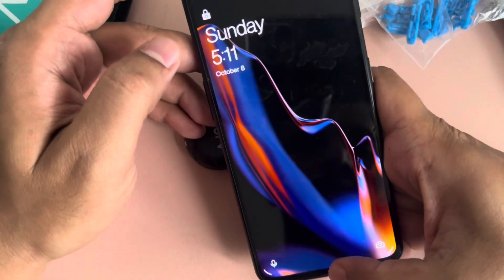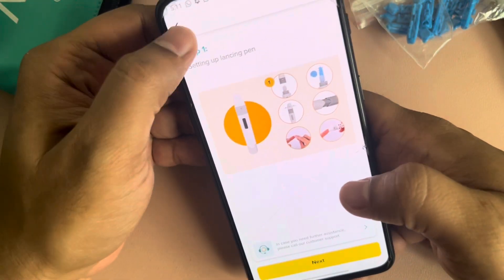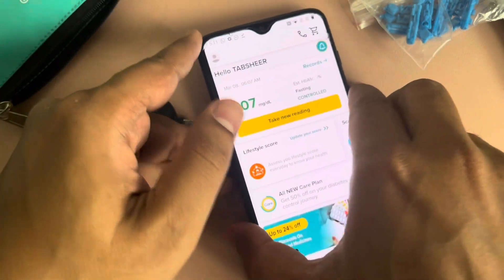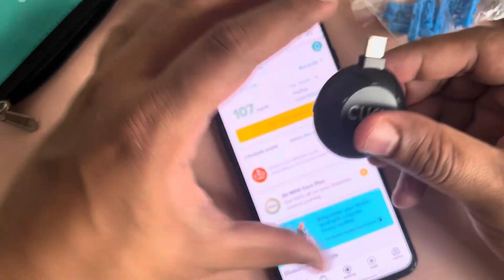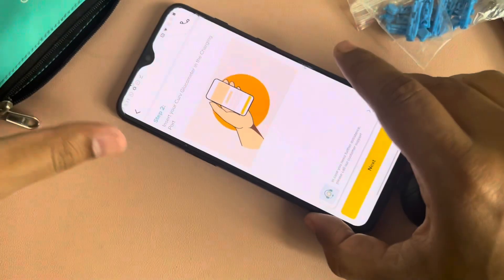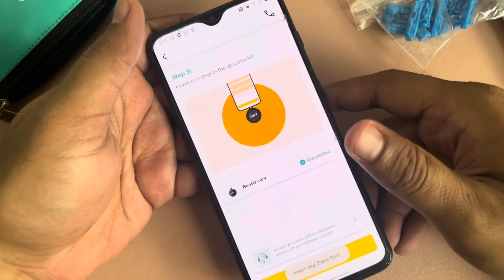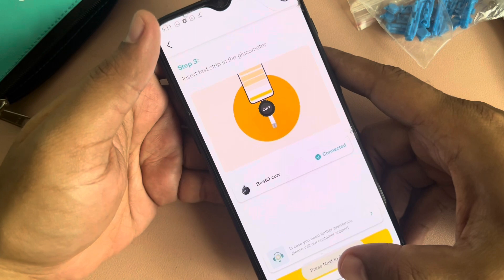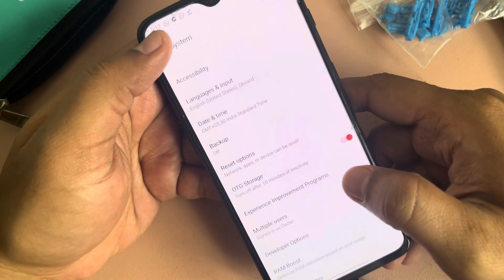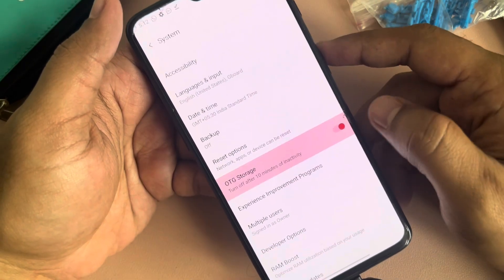You need to install the Beto app first of all, and log in with your phone number. Once logged in, you can insert the Beto Curve directly onto the phone and it should detect. Also make sure you enable OTG from your settings. You go to settings, search for OTG, and then enable it whenever you insert this device.